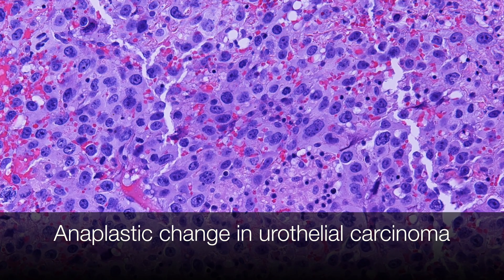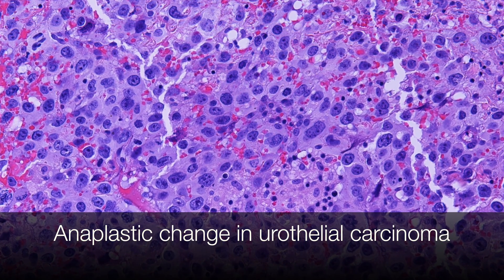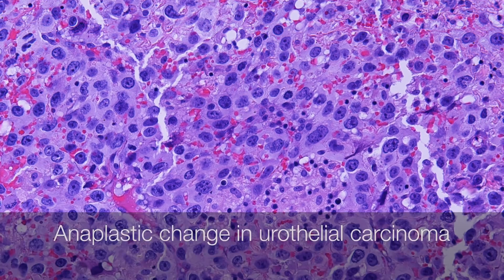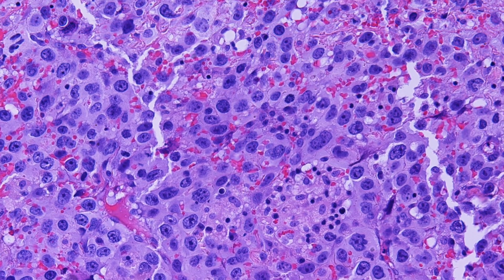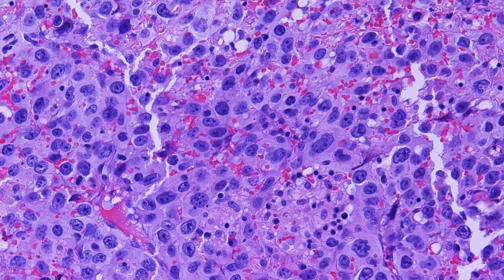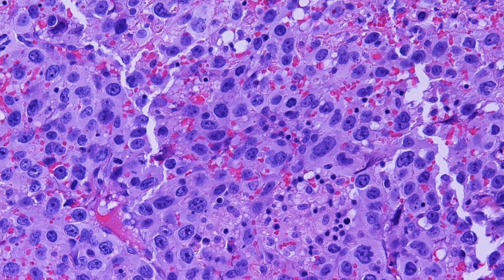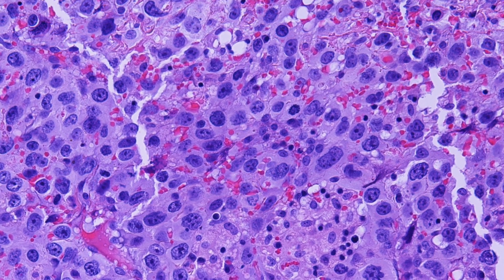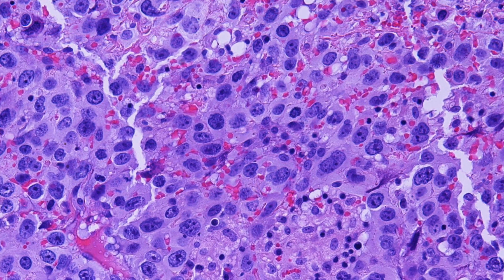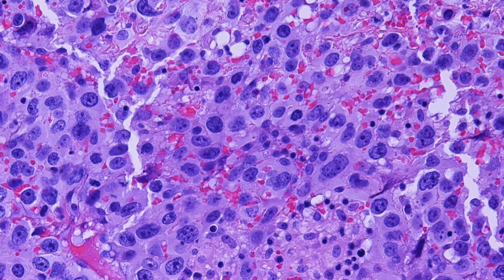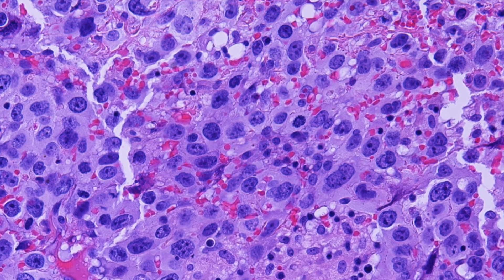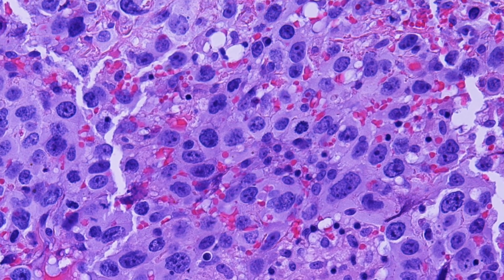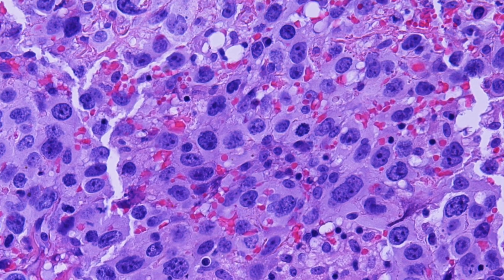This is an example of anaplastic change in a urothelial carcinoma. The malignant cells are undifferentiated and pleomorphic. If we didn't know this was part of a urothelial carcinoma, it would be impossible to say what sort of tumour it is without doing some further studies.